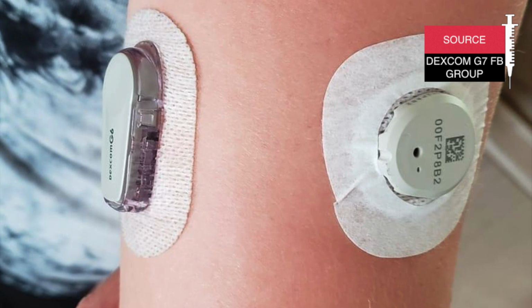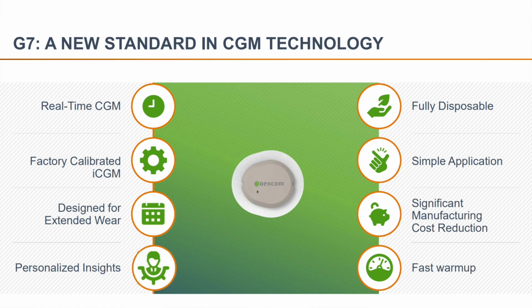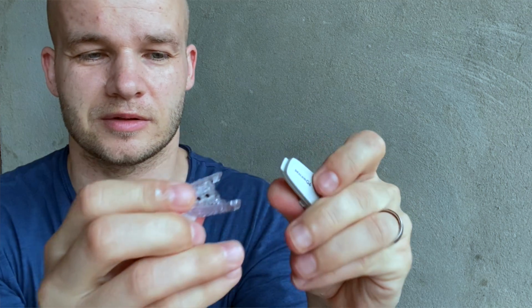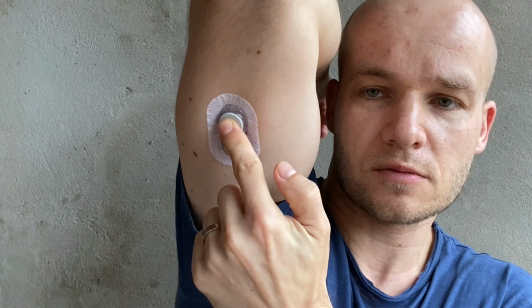The Dexcom G7 will be 60% smaller than the Dexcom G6. Its size will be somewhere between a quarter and a nickel, which is a great improvement, but it is still quite a bit bigger compared to FreeStyle Libre 3. The G7 will be fully disposable as well, and this is a big change, because its predecessor, the G6, came in two separate parts, and we used to move the transmitter from one sensor to another.